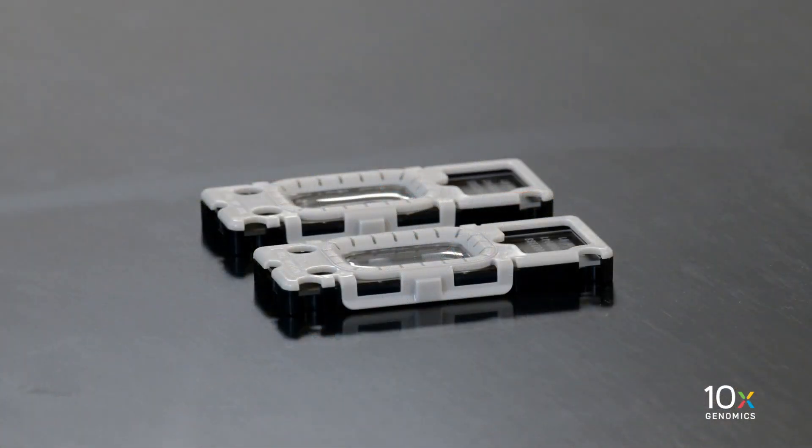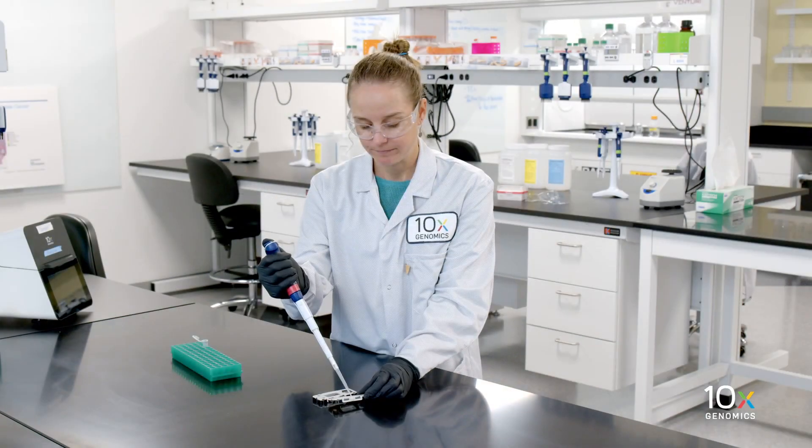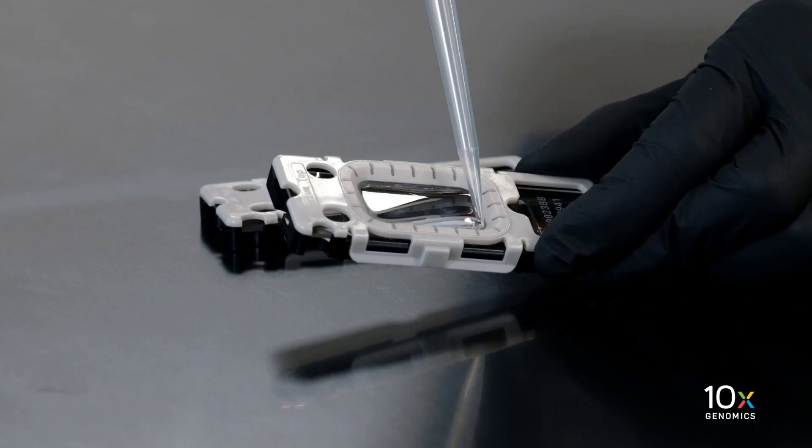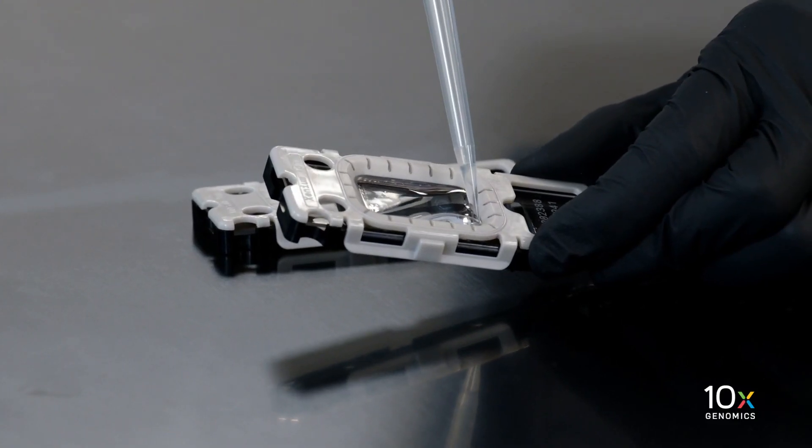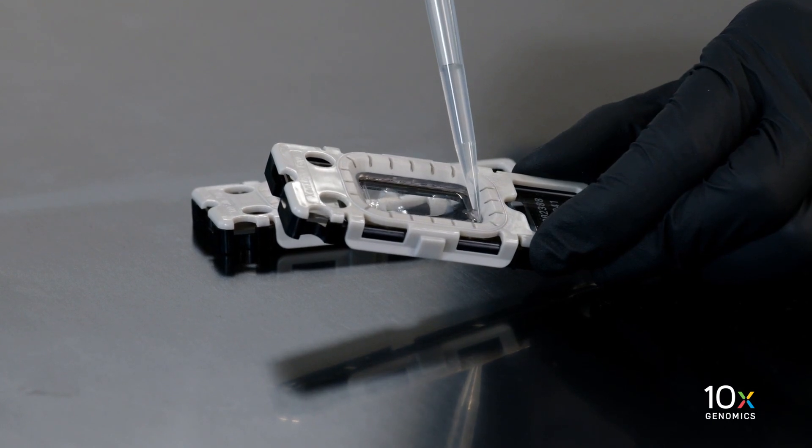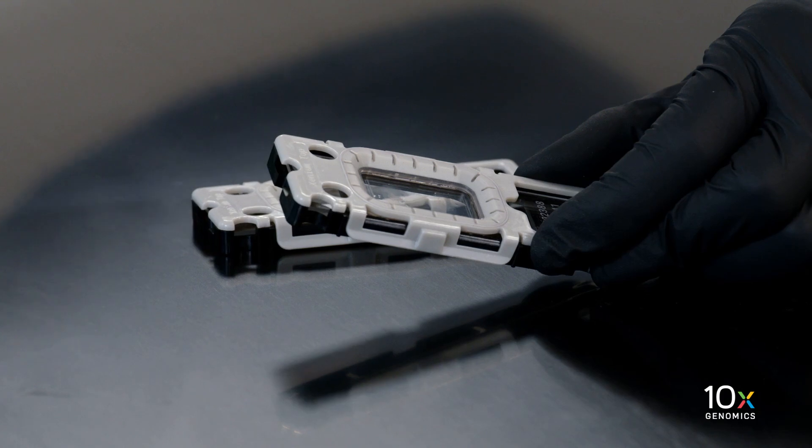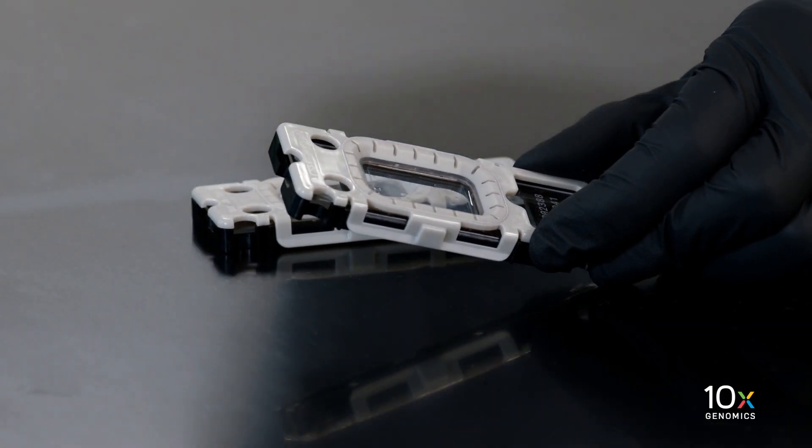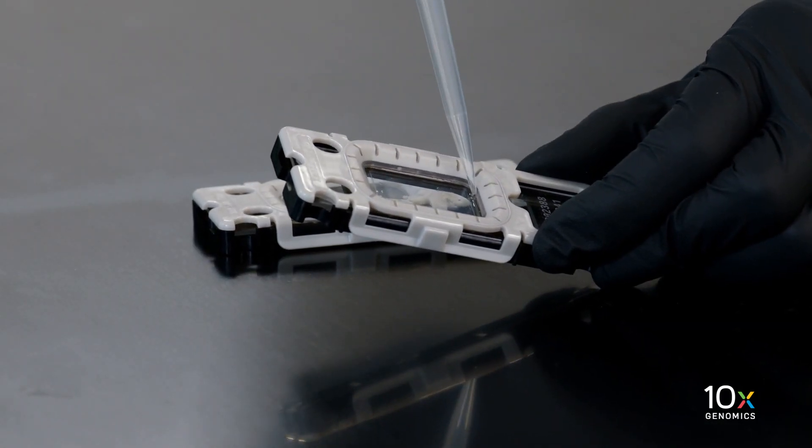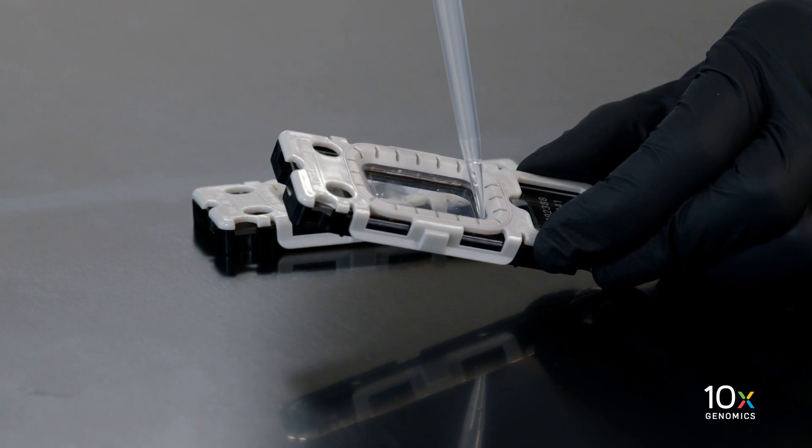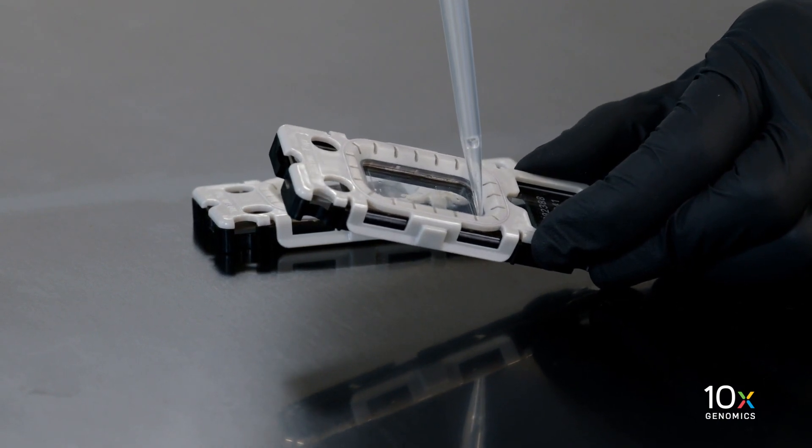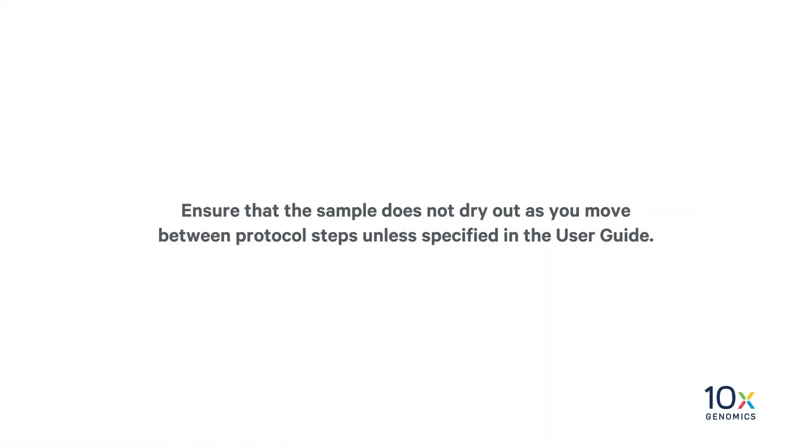Next, we will demonstrate removing liquid from the cassette. Slightly tilt the cassette while removing the reagent. Place the pipette tip on the bottom corner edge of the well. Remove reagents along the side of the well without touching the tissue sections when applicable and without introducing bubbles. Remove all liquid from the well in each step. Ensure that the sample does not dry out as you move between protocol steps unless specified in the user guide.